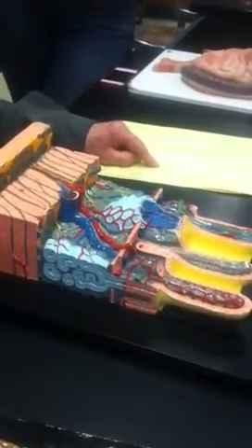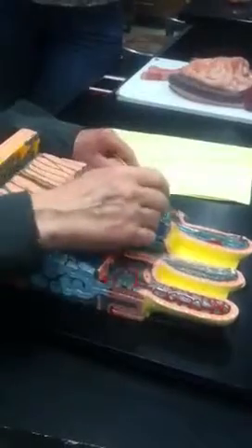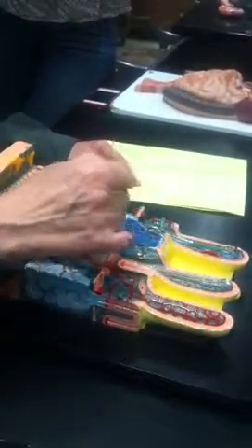Fats are absorbed into the lacteals. Fats don't go into the blood vessels. They go into a lacteal. So this green thing that you see in the center of each villus, you don't see it in these others because it's layered. But here we have this green thing. That is a lacteal. And of course, all these green elements that you see here are lymphatic vessels.